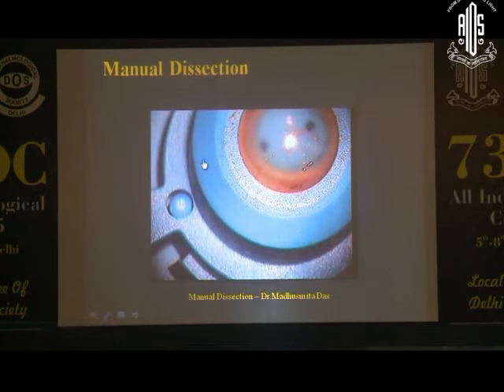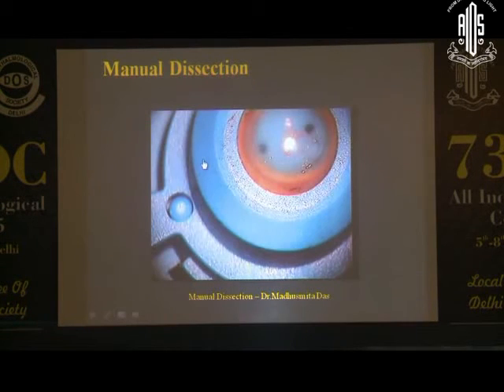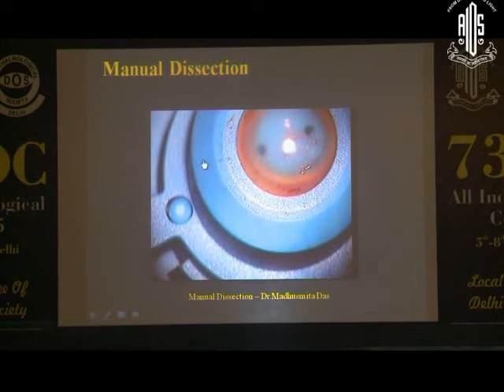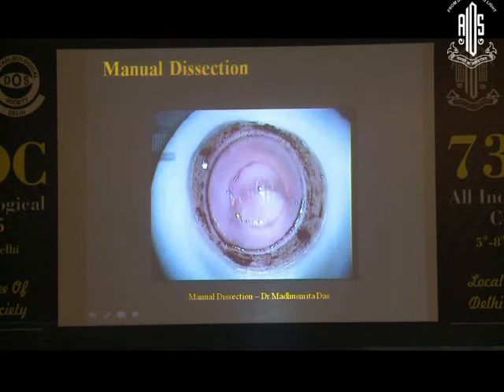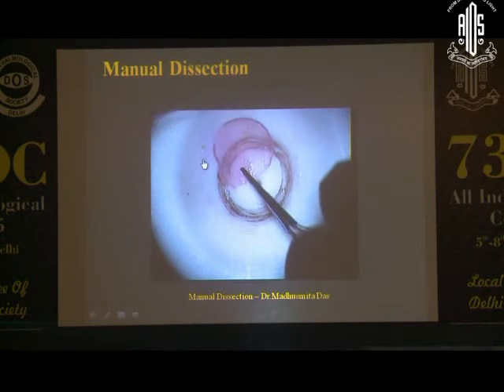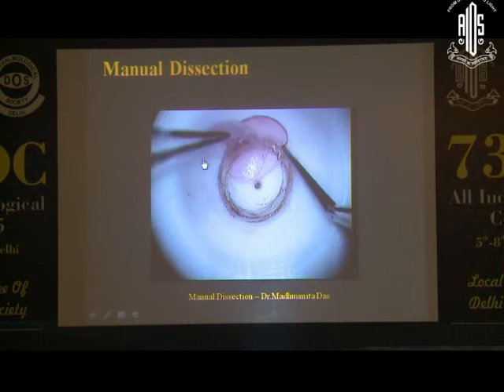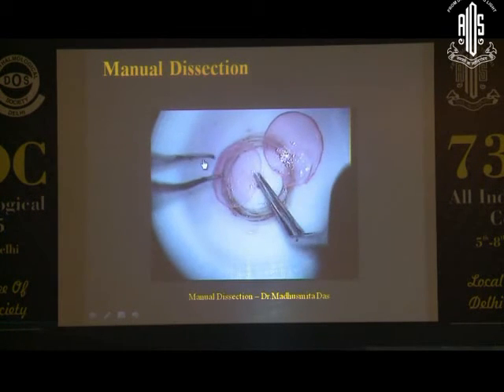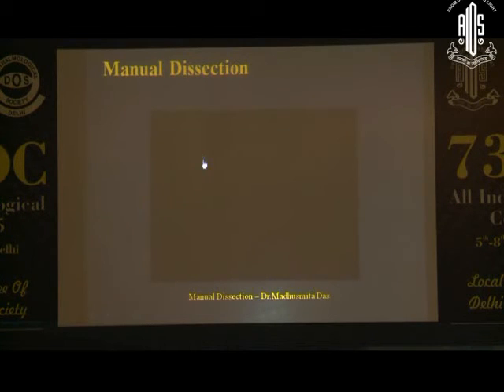Following this, it's important that while removing the donor button, we have to be careful that it has to be gentle, otherwise there would be caving in of the cornea, which would result in endothelial cell loss. This is the trephination which has been done, and then we can see a nice 8.5 millimeter lenticule, which has been achieved with the manual dissection.